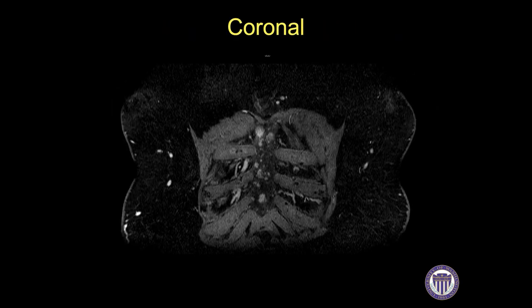I then look at the coronal and sagittal sequences, evaluating the internal mammary lymph node chains, axillary lymph nodes, sternum, and bones. Unfortunately, in one case, a woman had multiple metastases to her sternum, which were clearly seen on the coronal images.